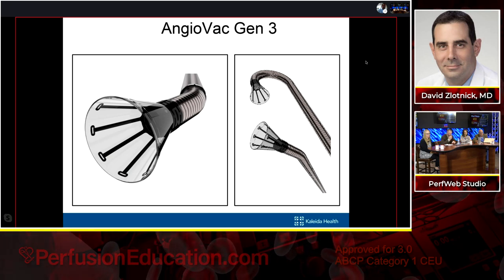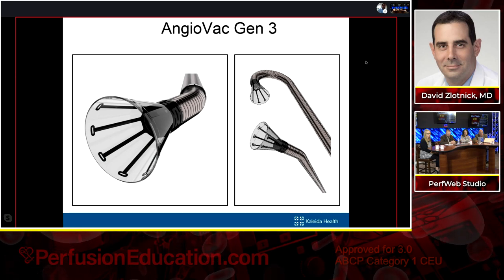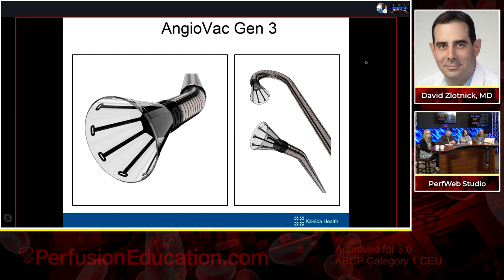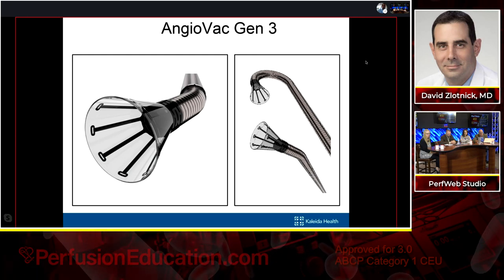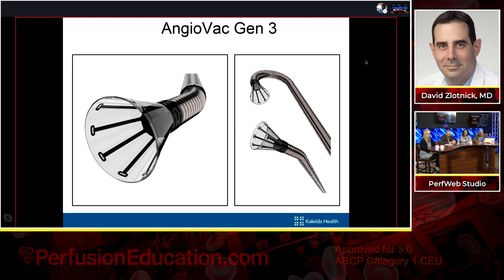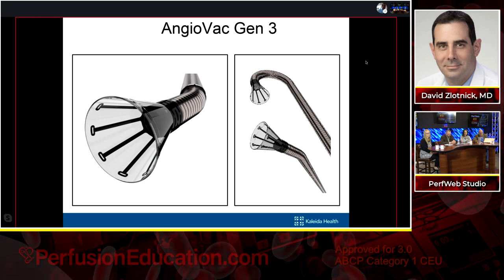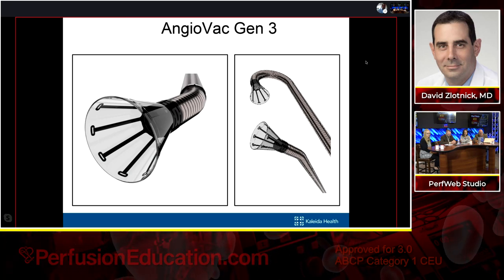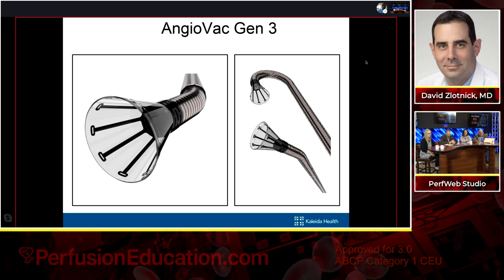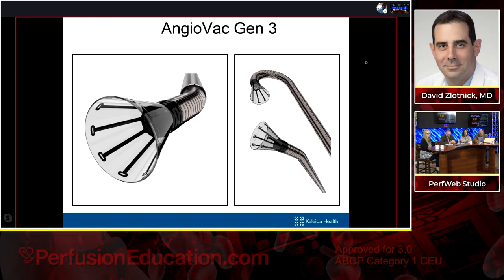but thankfully AngioDynamics came out with Gen 3 after seeing what we've struggled with. I think Mark went over this, but basically there's the oversheath and there's two different cannulas, the C180 and the C20. I just did a C20 procedure last week for an SVC thrombus. That curve is about what we need to go straight through the IVC and the right atrium and up to the SVC. But for the endocarditis, especially the tricuspid valve, the C180 is almost, I hate to use the word revolutionary, but it's been a godsend for us.